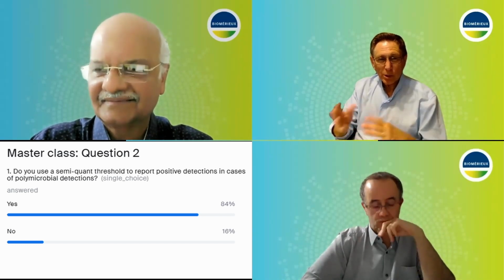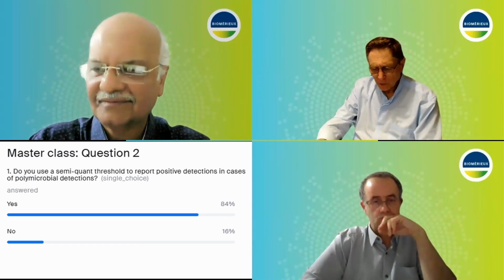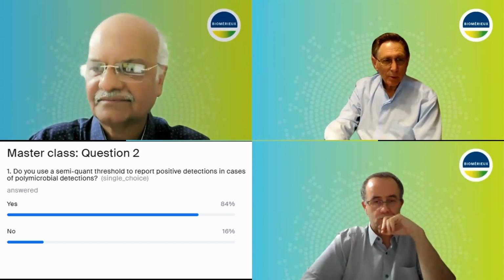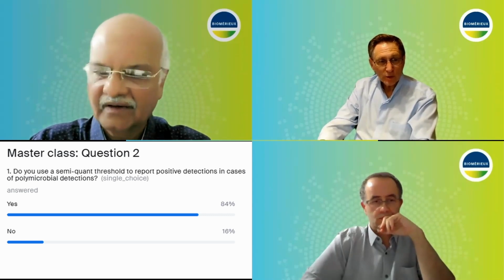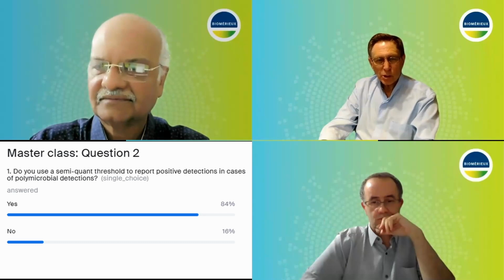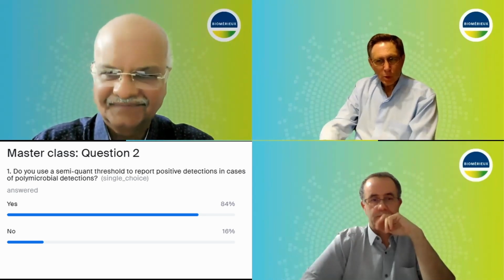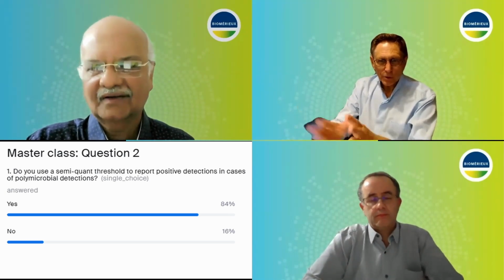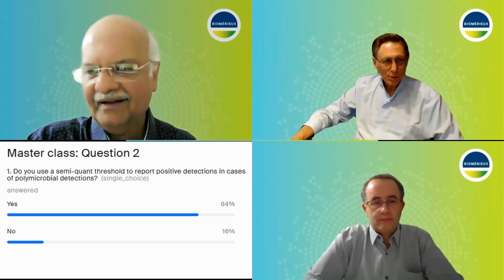But if you see things on gram stain that obviously do not grow culture-wise, if you're doing just plain old typical microbiology, some of them may be anaerobes. But it is useful to correlate because you need about 10 to the fourth, 10 to the fifth organisms to see them on gram stain. But it is interesting how often we see a discordance between what we see under the gram stain and what actually grows. So I'm curious about Dr. Soman's experience with that because it's confusing to me, and I've been doing this for a while.